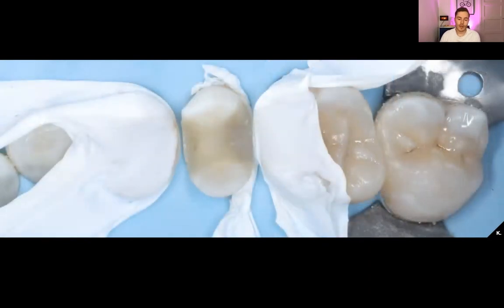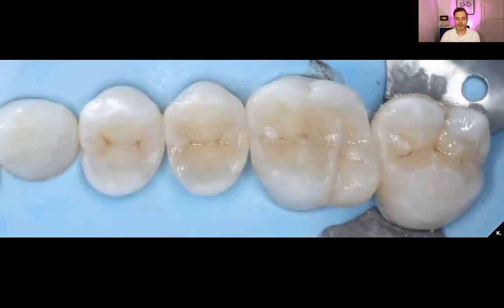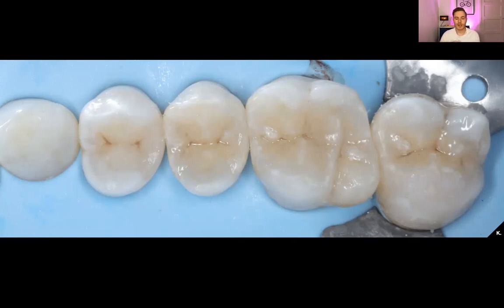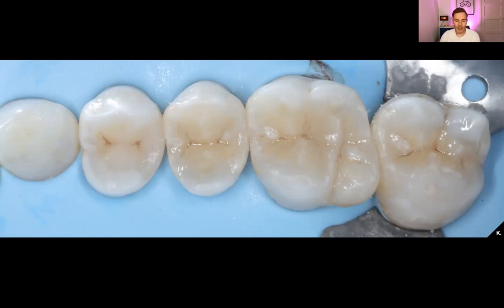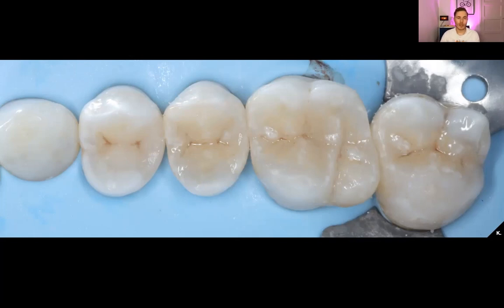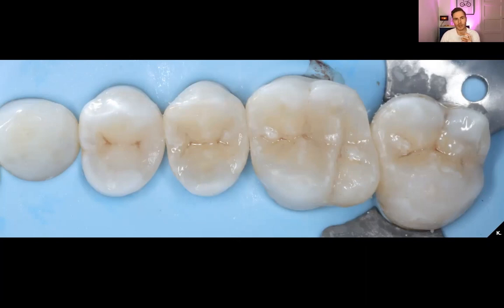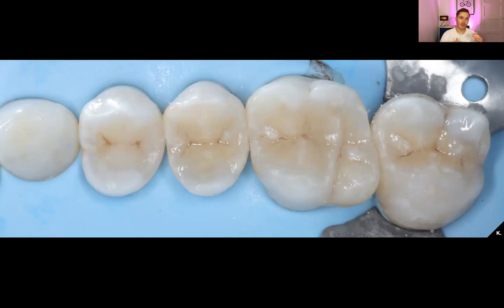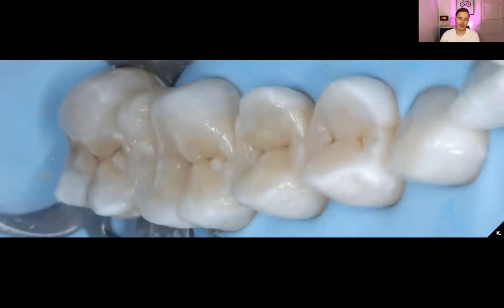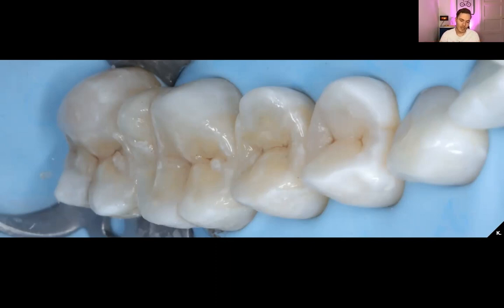Then we move on to the second premolar and repeat the same process. We can see the excess of composite, and this is what it looks like after all the teeth are cured. I already did a little bit of polishing — you can see a little bit of blood on the buccal side of the first molar. I use some IPR strips to make sure that the outline is really smooth. I can also use some ultrasonic tips that are perfect for polishing in between the contact points, and also some polishing discs and polishing burs on the incisal edges at the transition between my indirect restoration and the tooth. From another angle you can see that the anatomy is really nicely restored and that the restorations integrate really well — it looks like just a natural dentition.